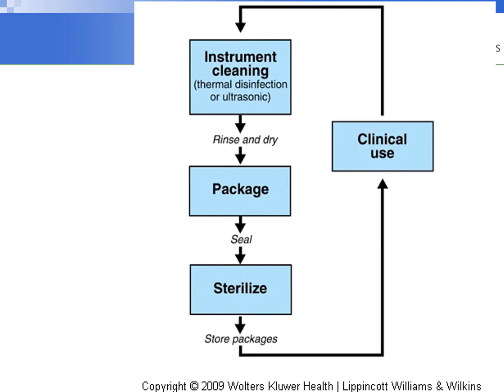You walk in with an enter into the non-sterilized section of it, and then you clean your instruments there. You would clean all of your instruments, and they're all contaminated. You need to disinfect them and rinse and dry them, and then we package them in the middle, and then we seal them and put them in an autoclave for sterilization. Then there's a counter where we put them so that they can dry. We stack them all up. So it's a one-way. Ours just goes the opposite way, but you need to have an entrance and an exit.